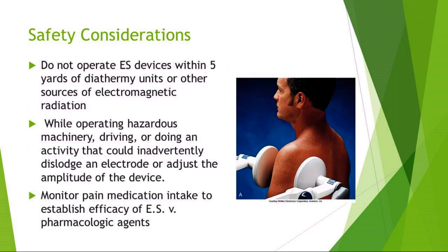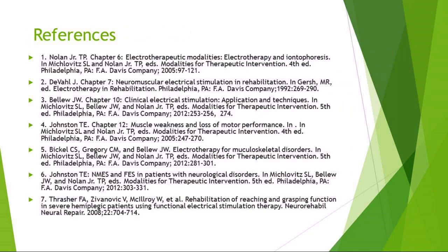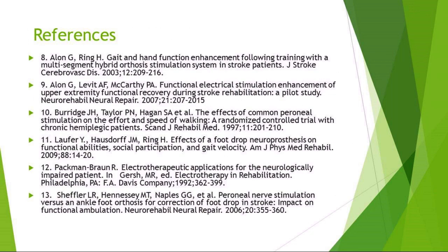So you don't want to operate electrical stim devices within 5 yards of diathermy units or other sources of EM radiation. We'll talk about EM towards the end of the quarter. Obviously, you don't want to do electrical stim while operating hazardous machinery, driving, or doing an activity that could inadvertently dislodge an electrode or adjust the amplitude of the device. You want to monitor pain medication intake to establish the efficacy of electrical stim versus pharmacological agents. This is a whole list of references talking about that you can look through.